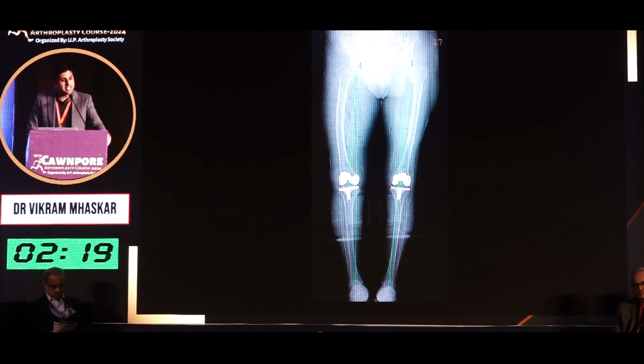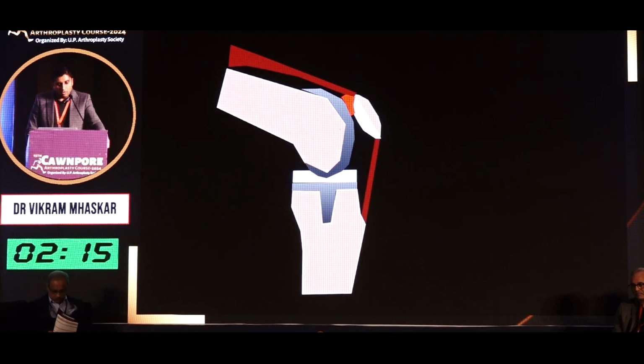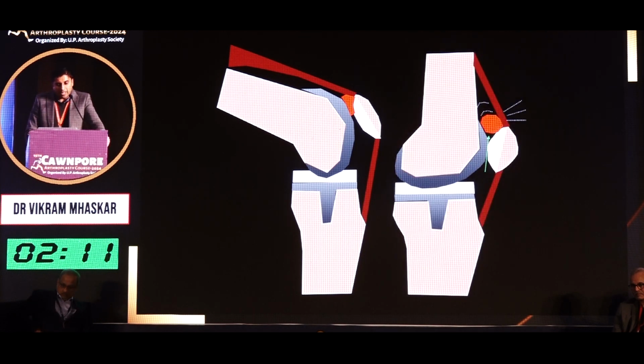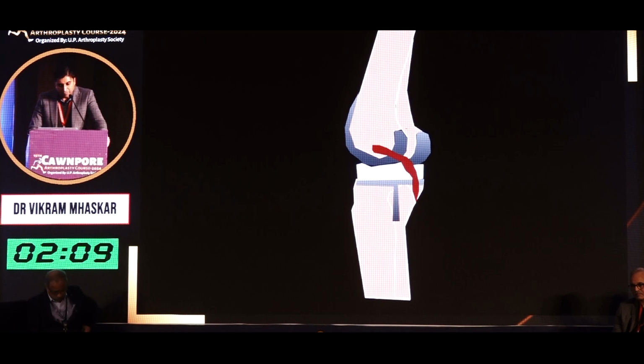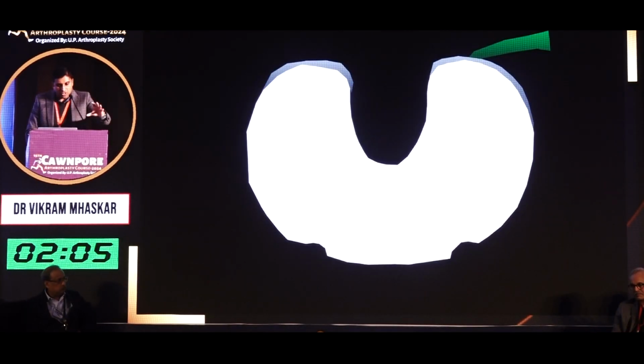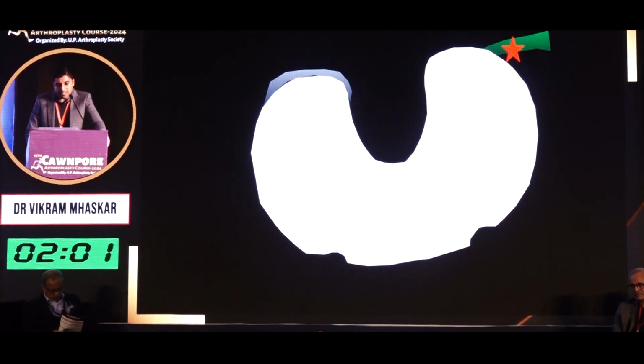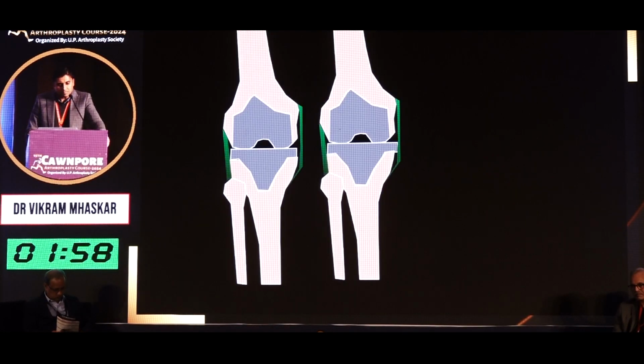So these X-rays help early on, even a CT scanogram, to see how your components are placed. And the age-old PS associated patellar clunk syndrome should be identified. Always put your tibial component in the right position, especially laterally. There shouldn't be overhang because that could lead to popliteus tendon impingement and pain.